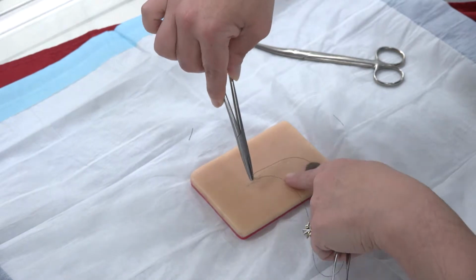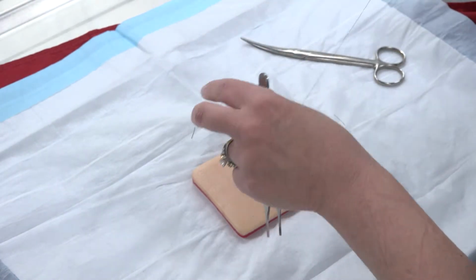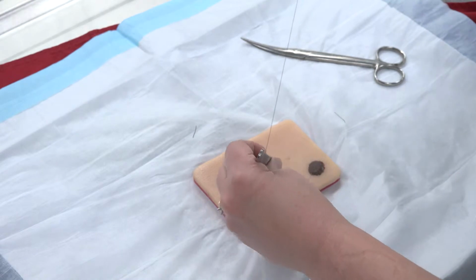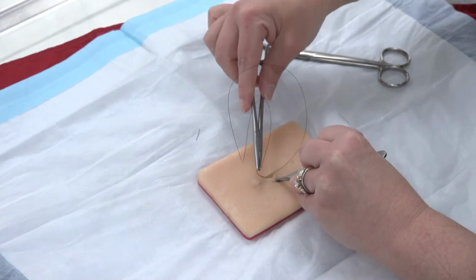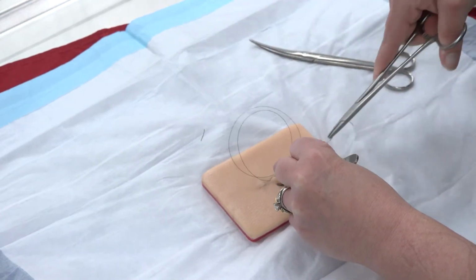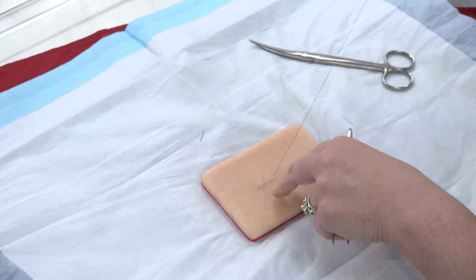Now I tend to not use my forceps as much on the skin. It bruises the skin, but especially when you're learning, you tend to need to use your forceps on the skin a little bit more, or on that subcutaneous skin junction. The other thing that makes this easier is the more perpendicular you are to the skin when you make your initial incision, the easier this is.